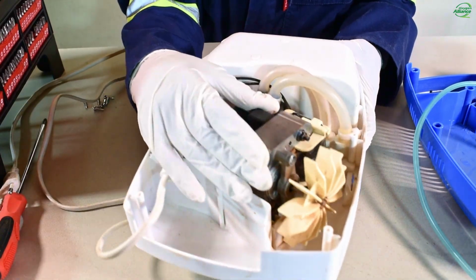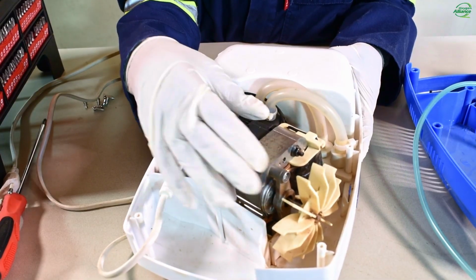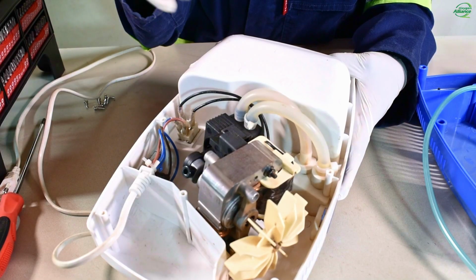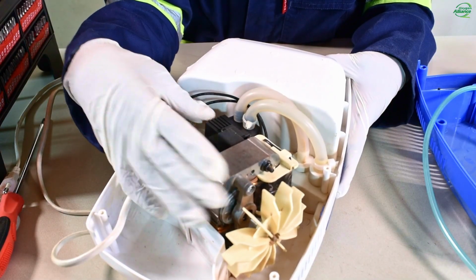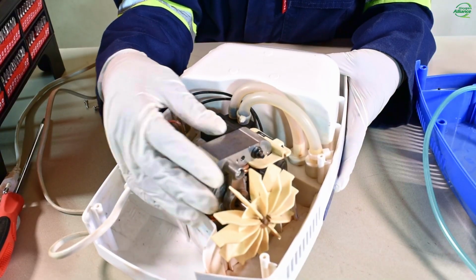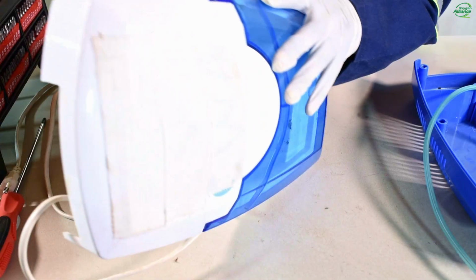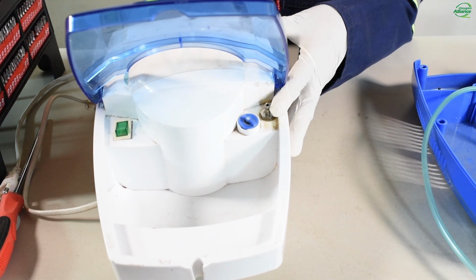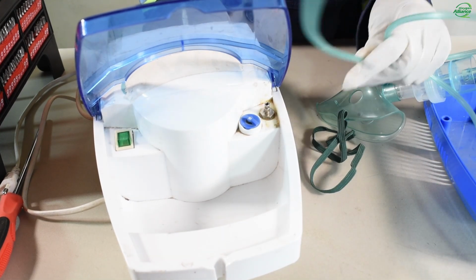This is the compressor unit. Before the ambient air enters the compressor, it has to be filtered. This is the filter. Once the air has been filtered, it passes through this tubing and it enters the compressor where it is compressed. After it has been compressed, it passes through this tubing before it exits the nebulizer through this outlet. After that, the air proceeds to the nebulizer kit through this tubing.